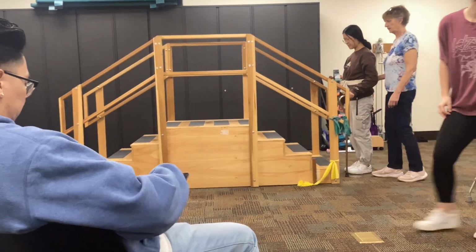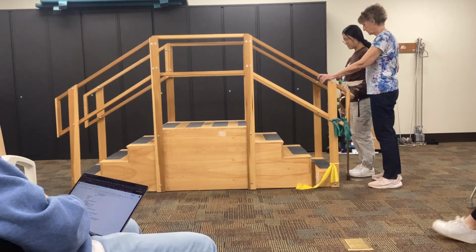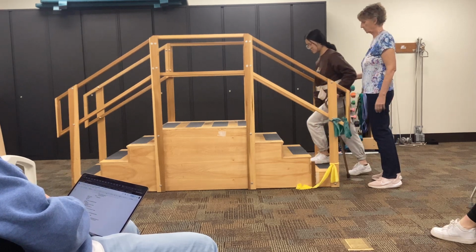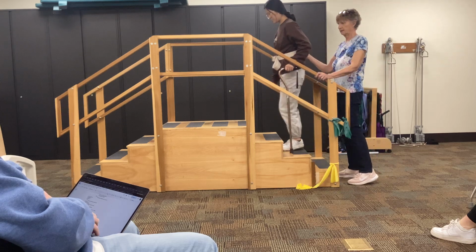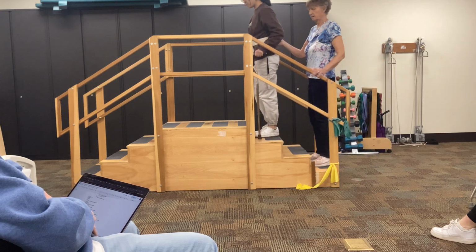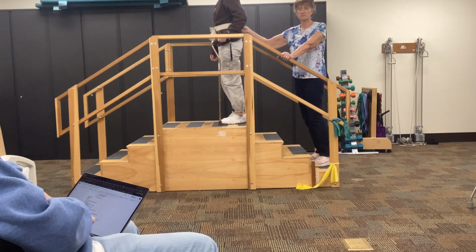All right, so let's take a look at the stairs. Stairs. All right, so which leg is going up first? All right, go ahead. And push in the bad leg. Good leg, push in the bad leg. Okay. And that's how the stairs are gonna look with 1 cane.